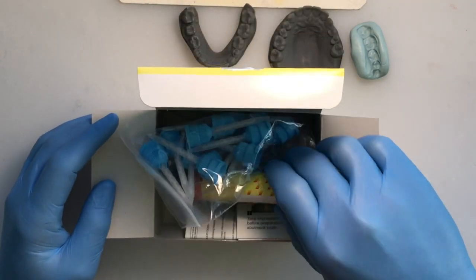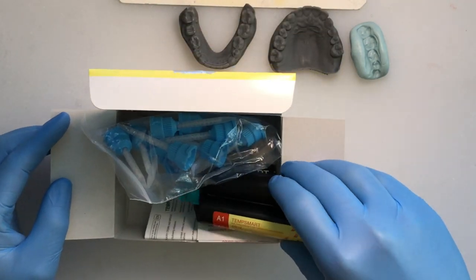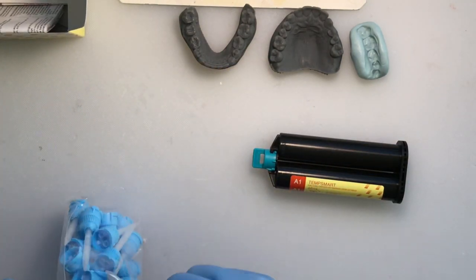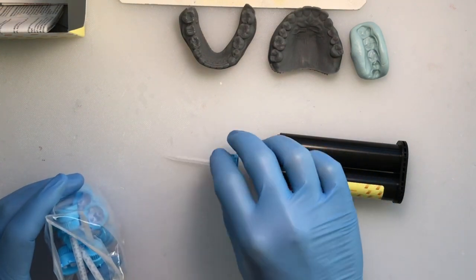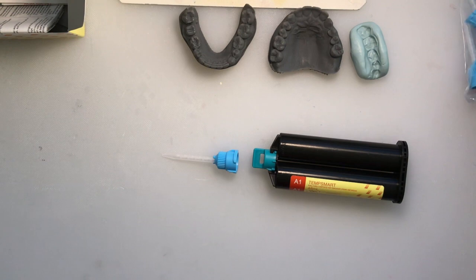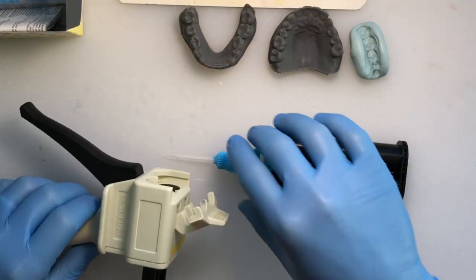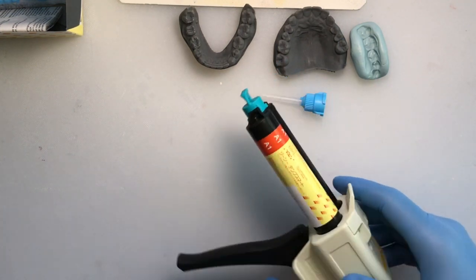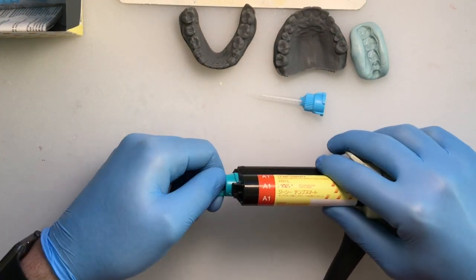It comes packaged very similar to other materials. It has a dual cartridge carrier that when placed into an extrusion gun with the proper tip in place will allow proper mixing of the materials to allow the adequate setting and strength of the material.